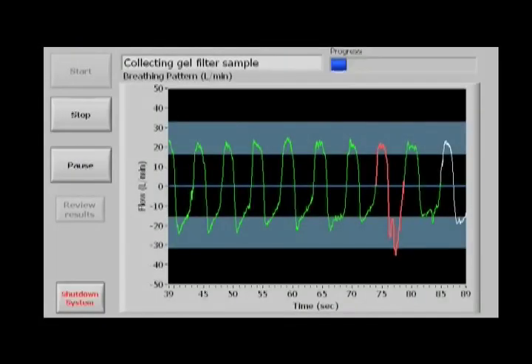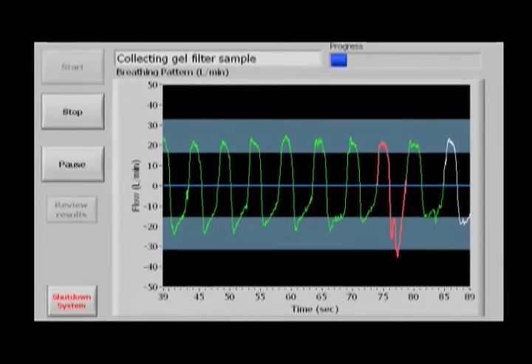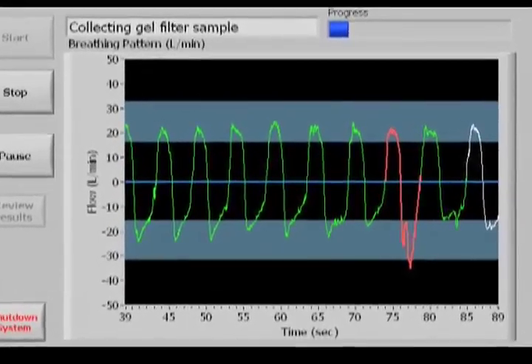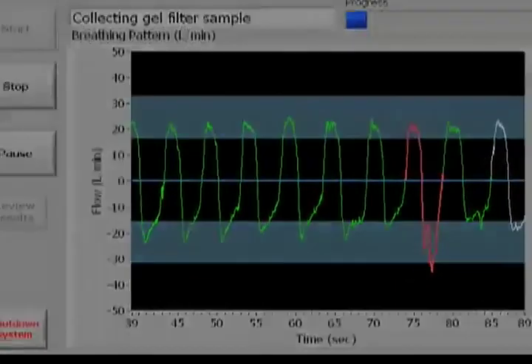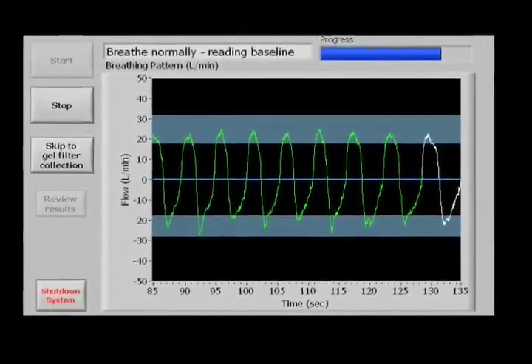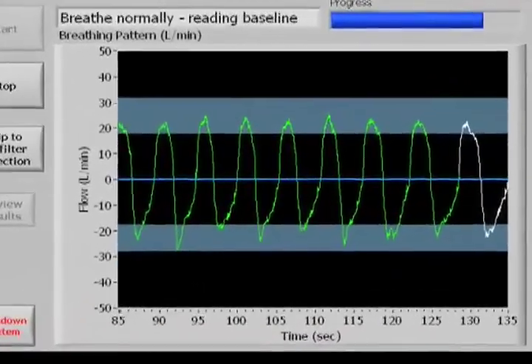Gray bars will appear on the screen with wide target ranges. When the top and bottom of the breathing trace land in the gray zones, the picture of the breath will turn from white to green. Ones outside the target gray zones will turn red. The user needs to complete ten green breaths to pass the practice round. A blue progress bar shows how close they are to being done.